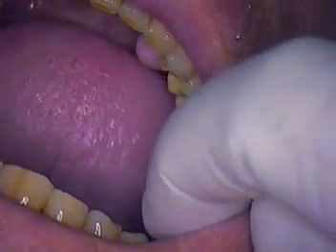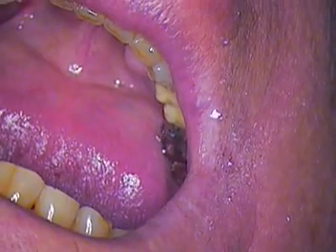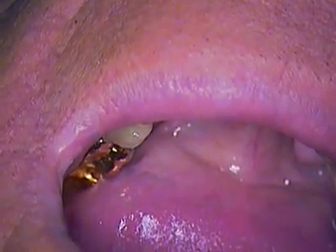We're going to go ahead and take a look at John now. The dental surgeon, the periodontist, has already told us that it's 2 millimeters in depth of tissue height. Okay, let's go have a dry angle, please. John, I'm going to use a little dry angle that's going to go up and protect your cheek. And we have John today. He actually has his video eyewear on. We'll just show you those. That's a video eyewear, and he's watching as we're treating today. John, can you see all right in there? No problem. Okay. Gray mirror.